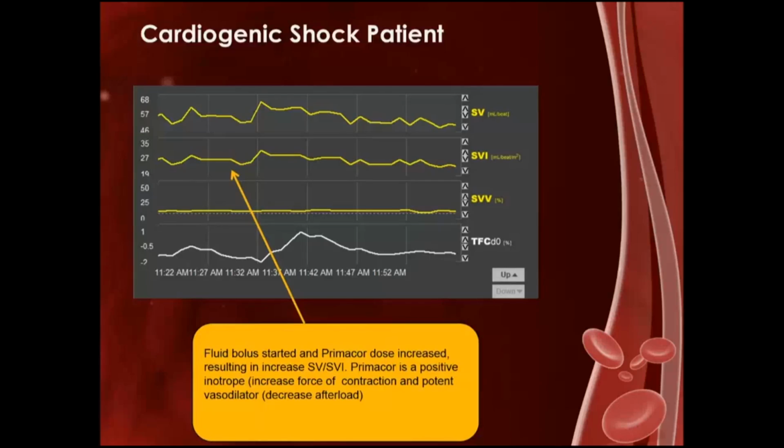But now the cardiologist came in, and he didn't feel comfortable with the values of the NICOM. He was convinced, because of his viral myocarditis, that this patient needed to be diuresed. He felt that if he put a Swan in, the wedge was going to be 25, but he didn't want to put the Swan in. So because he was so convinced that's what he needed to do, he ordered diuretics. And here I am, caught in the middle. You saw what improvement you got today by giving that fluid, and he was fluid responsive. If you give the diuretics, you're going to counteract all this effect.